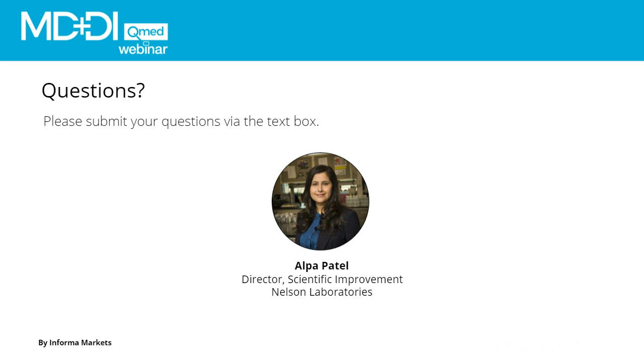Okay, great. Here's our next question. How final are the test articles expected to be? In other words, in a development program, is design equivalent acceptable as opposed to production equivalent? Because these are validations that are going to be used for submissions, they have to be in final configuration.